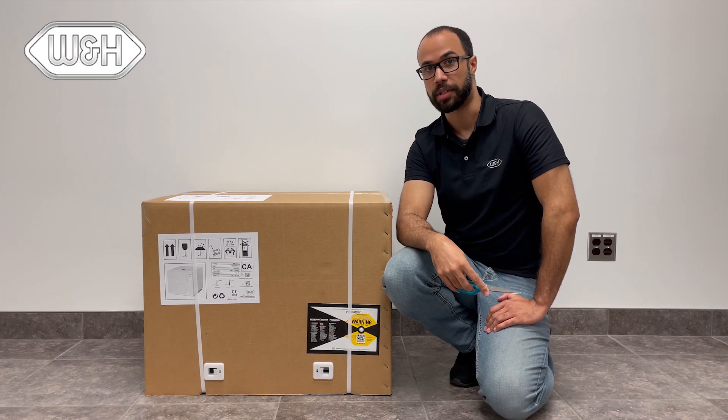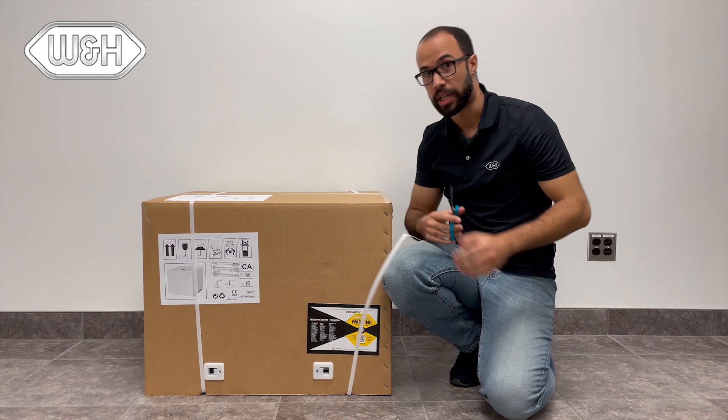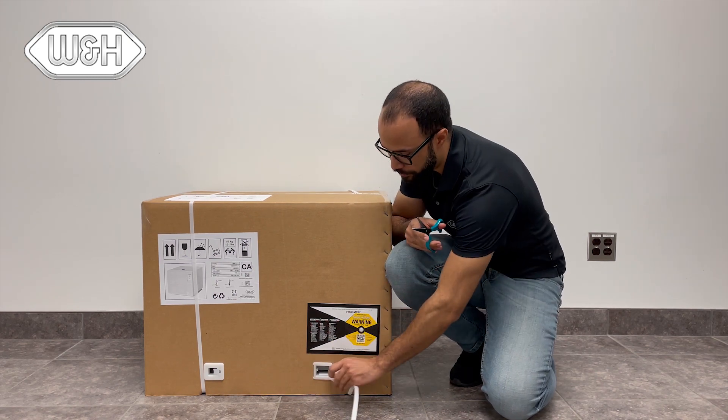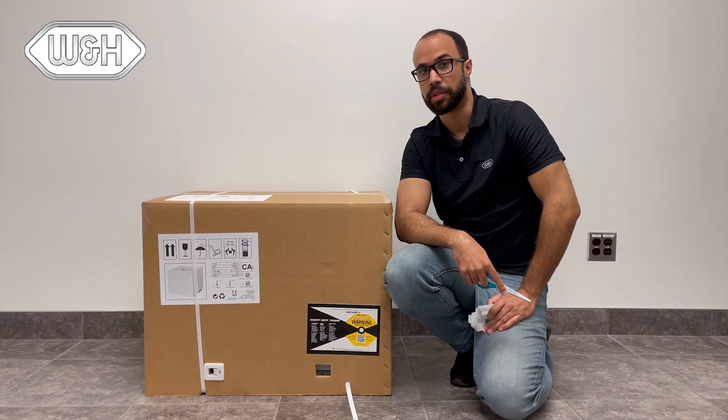The sterilizer comes packaged in a heavy-duty box to protect the Lexus during shipping. First, cut the straps and remove the strap inserts. Once completed, you can remove the top portion of the box.